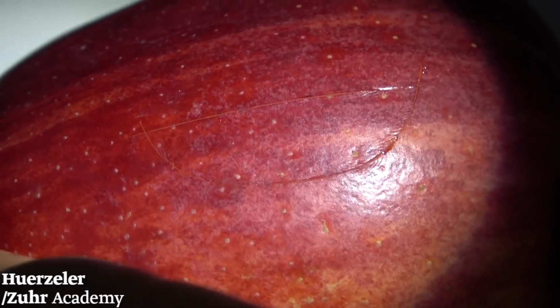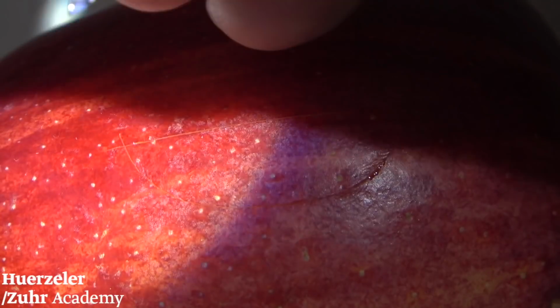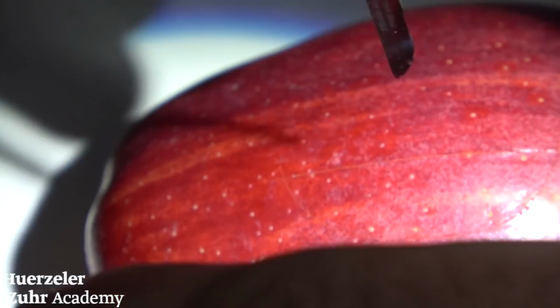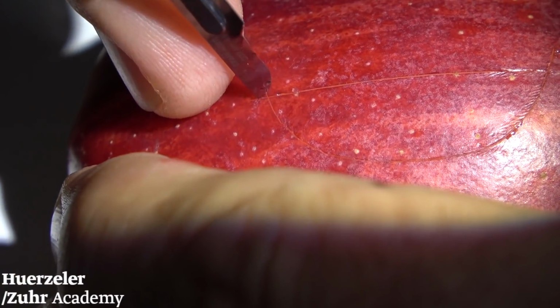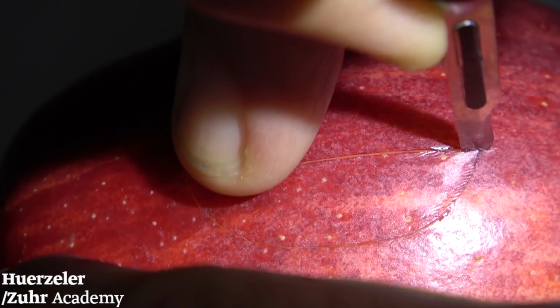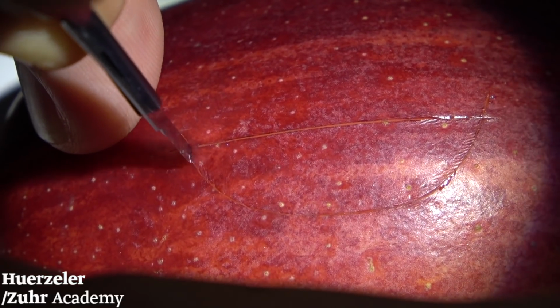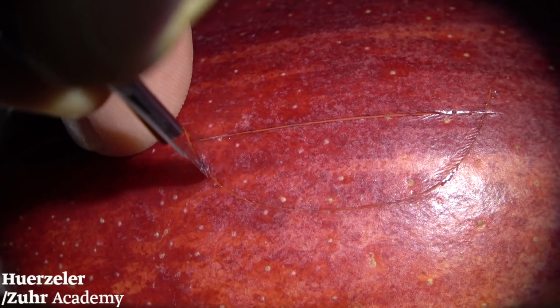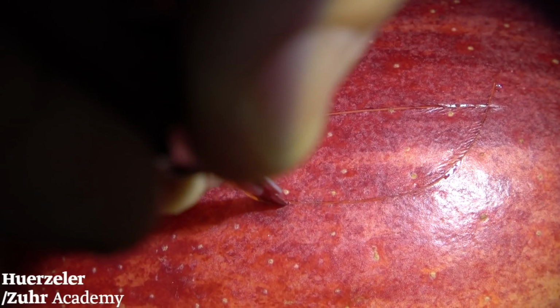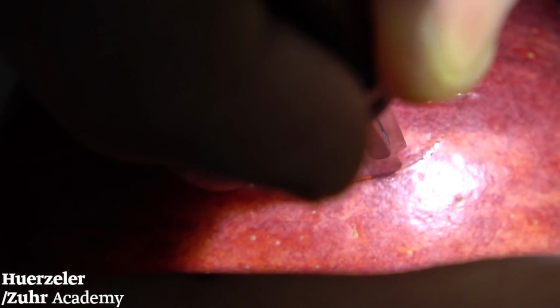Remember, my incision was done perpendicular on the surface. My incision was a little bit more than 2 millimeters deep. So the first incision is always a little bit deeper than your flap design should have. I just repeat it for you so that you can see it better and everybody understands that. I always try to be exactly perpendicular on the surface.